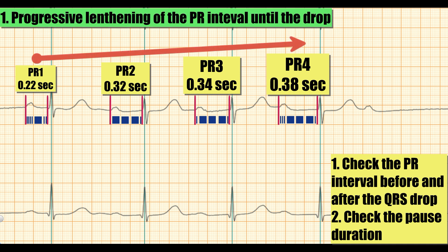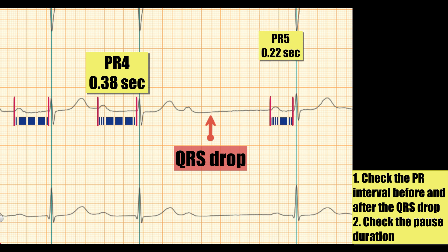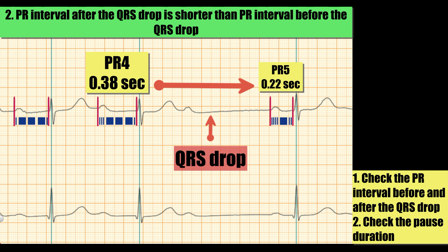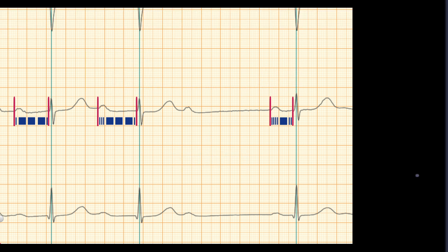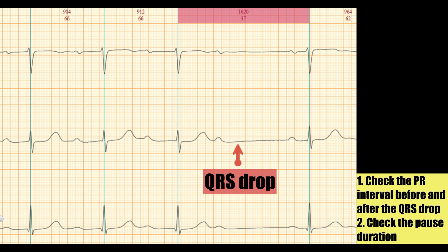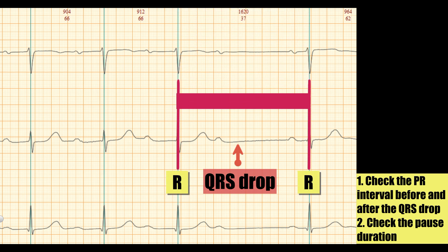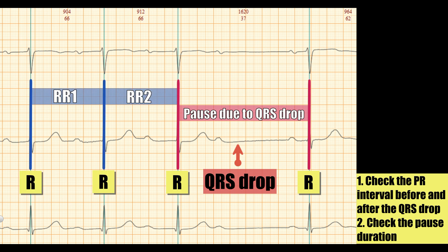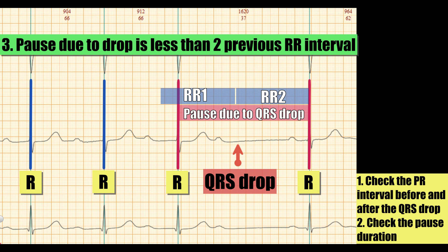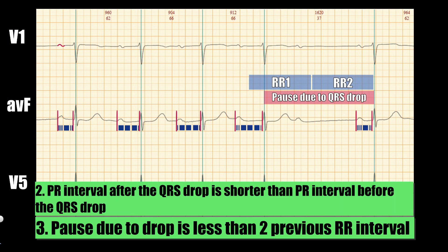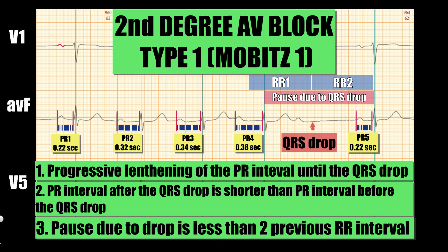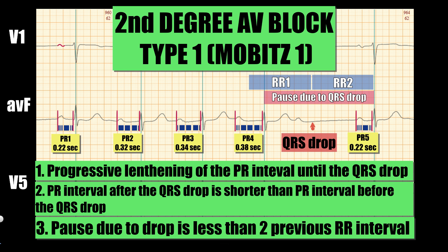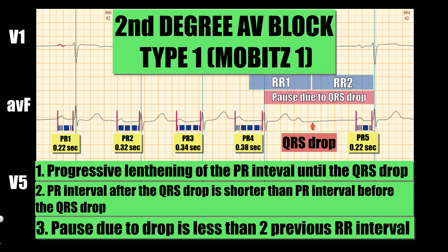PR intervals progressively increase until the QRS drop. The PR interval after the QRS drop equals 0.22 second — shorter than the PR interval before the drop. The pause duration due to the drop is also less than two previous RR intervals. Progressive PR interval prolongation until the QRS drop, together with a shorter PR interval after the drop and a pause less than two previous RR intervals — all of this indicates 2nd degree AV block type 1, or Mobitz 1.